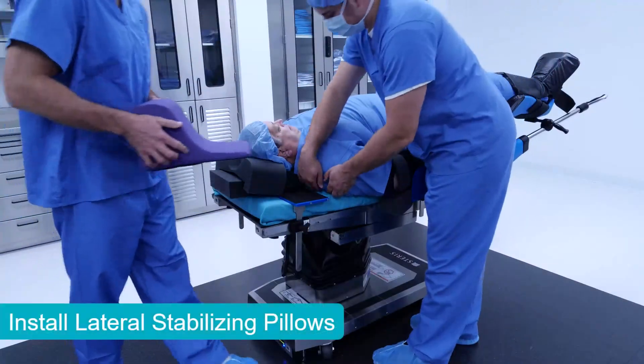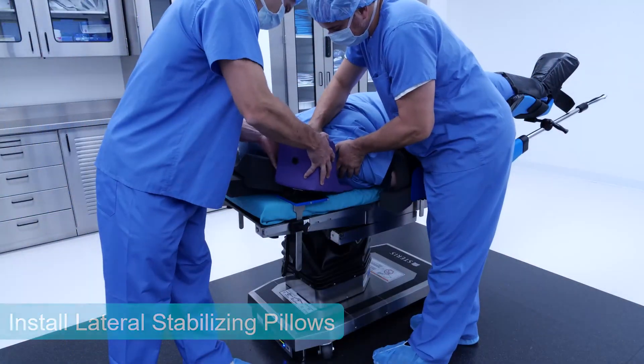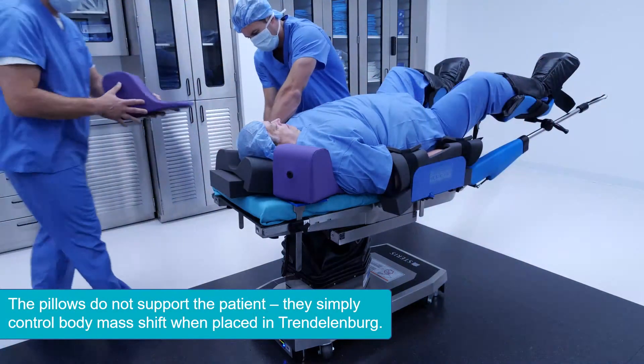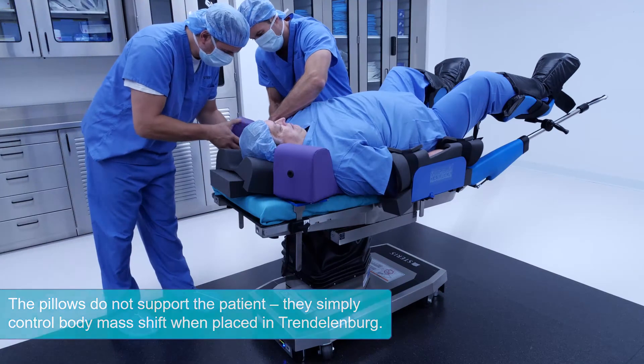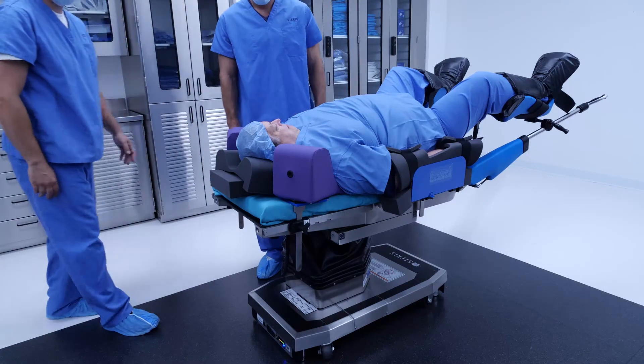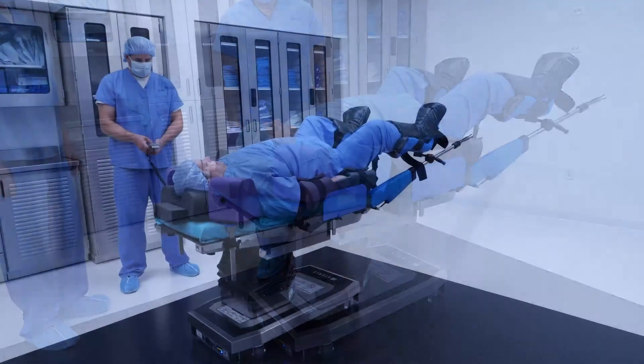Install the lateral stabilizing pillows. They are not shoulder braces. They simply control body mass shift when transitioning from supine to steep Trendelenburg. As you can see, they are completely non-structural and do not play a role in keeping the patient from sliding.